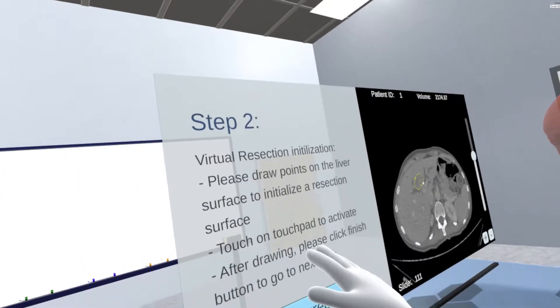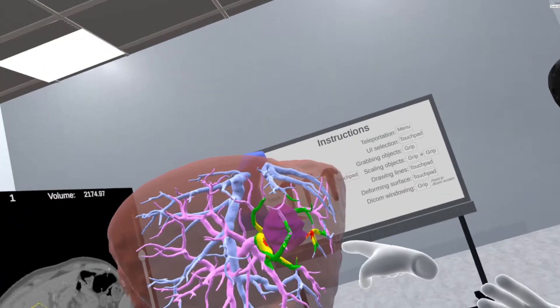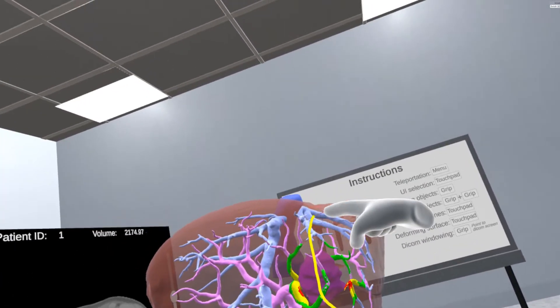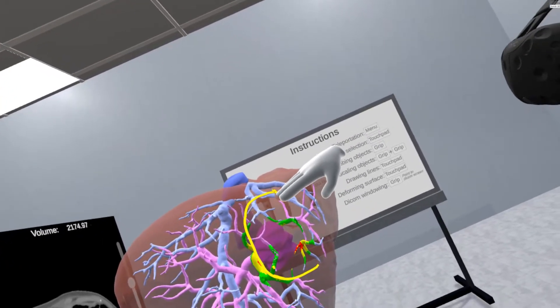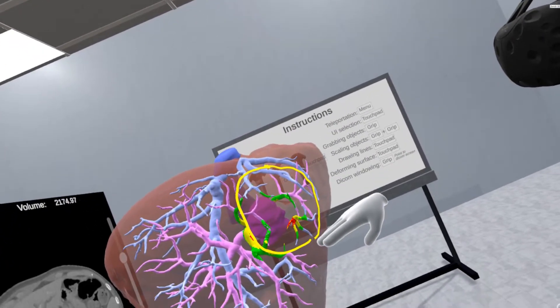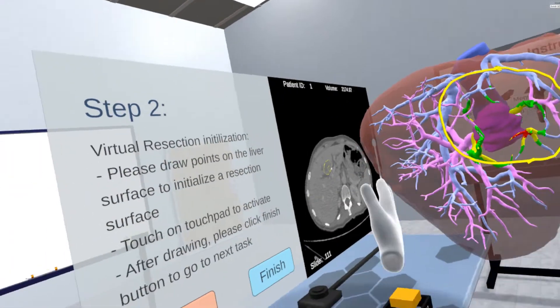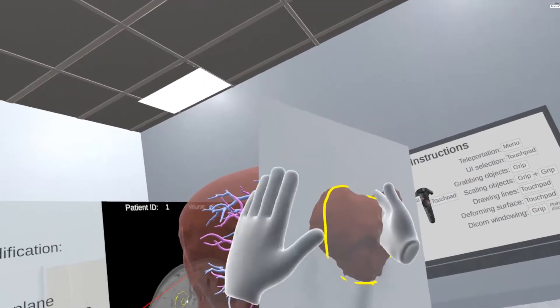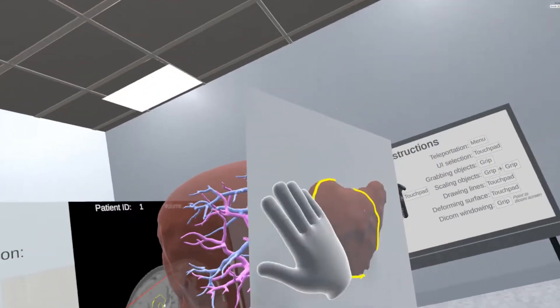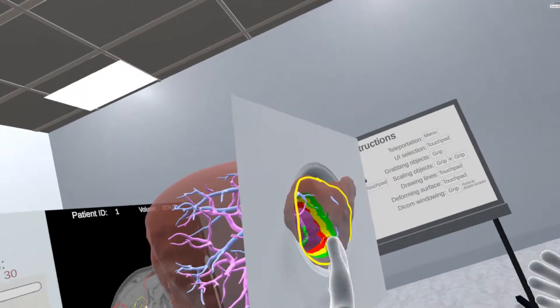For virtual resection initialization, it is required for the users to draw lines on the liver parenchyma surface. The reason for drawing lines is to enable the user to specify the location and direction of a resection surface. The initial resection surface is computed by means of a principal component analysis from the lines drawn by the user. We also attempt to generate an automatic deformation based on this drawing.